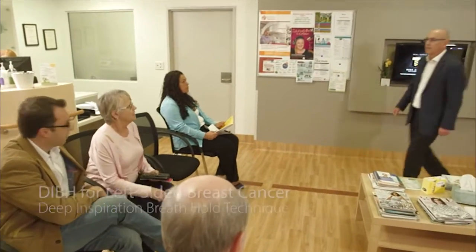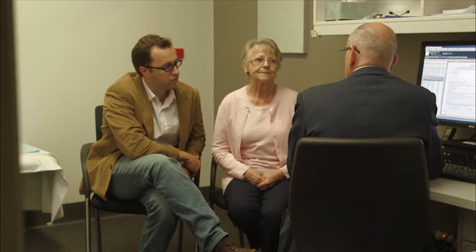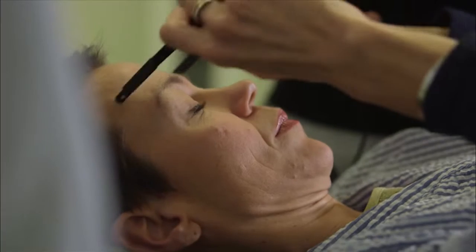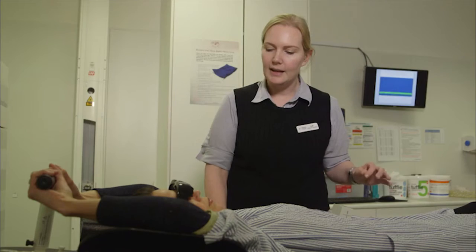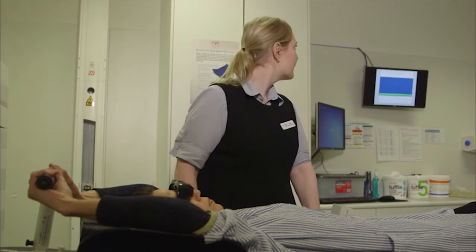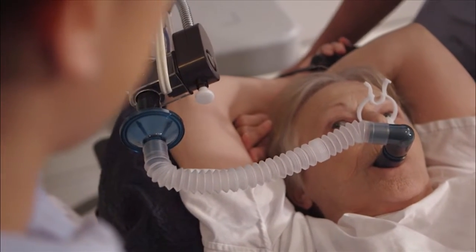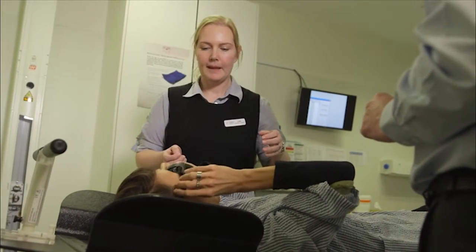Radiation therapy is a safe and important treatment for breast cancer. People with left-sided breast cancer are often concerned about minimising the risk of radiation delivered to the heart. There are many ways to minimise this risk. Deep inspiration breath hold, or DIBH, is the most efficient, safest and simplest of these techniques. We currently use two different breathing methods, a snorkel or goggles.